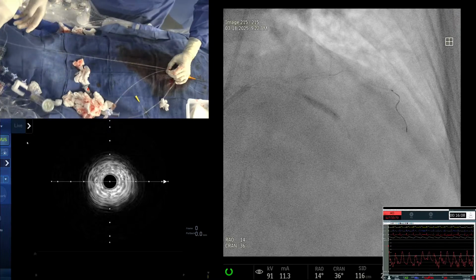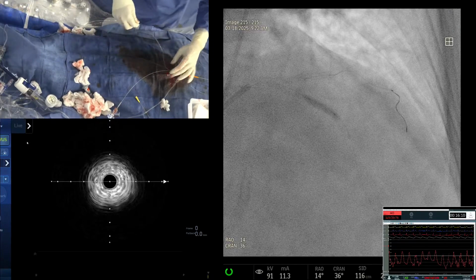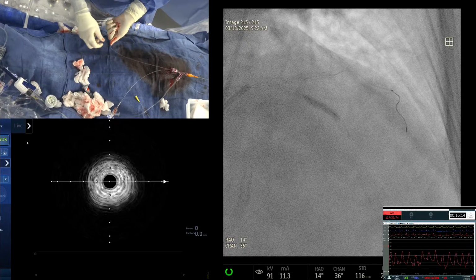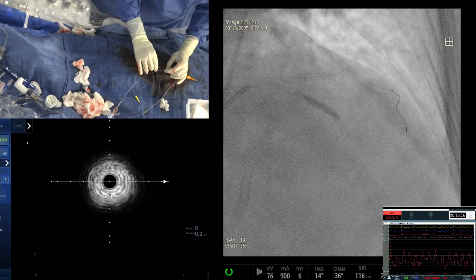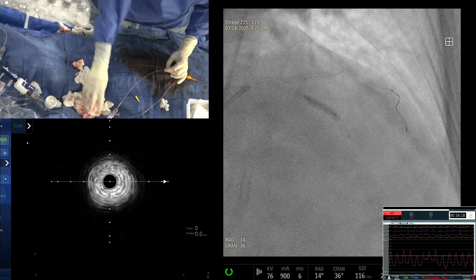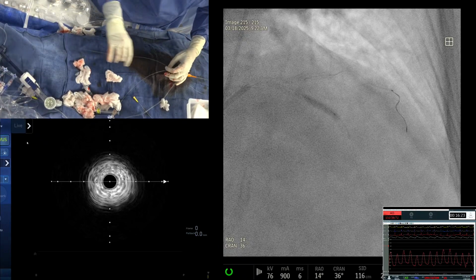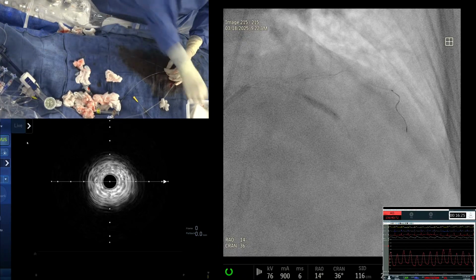Yeah, that actually is the criticism a lot of people make of the mini crush. Your balloon has ruptured in the LAD now. No, it did not, that was my finger outside. Okay, I think it's ruptured. Anyway, let's get a 1.0 balloon, otherwise Corsair or recross.